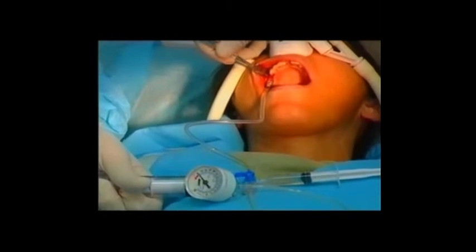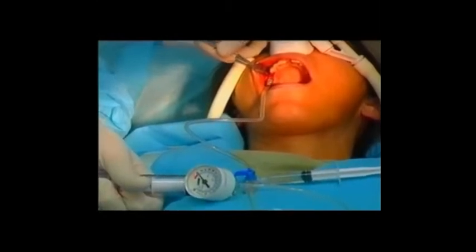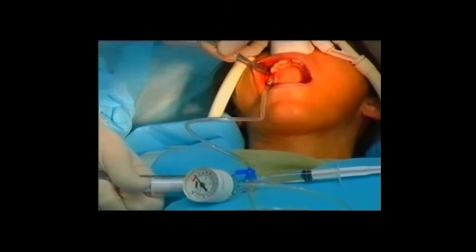Subsequently, the balloon is inflated with progressively higher volumes of contrast fluid. The balloon inflation and membrane elevation are evaluated by sequential periapical radiographs. Once the desired elevation is obtained, the balloon should be left inflated for five minutes to reduce the sinus membrane elasticity.